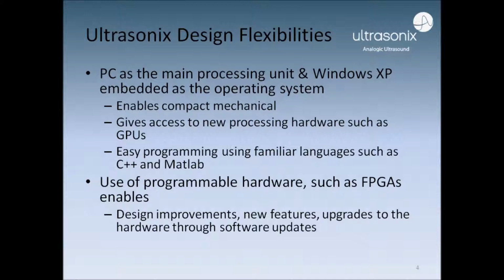We use Windows XP as our operating system, and this has made it possible to program the system in familiar environments such as Visual Studio and MATLAB. On the hardware side, we use a lot of programmable hardware such as FPGAs, which makes it possible for us to incorporate design improvements and new features as upgrades to the firmware. These can easily be distributed as software updates for the system and provide great flexibility on the hardware side.